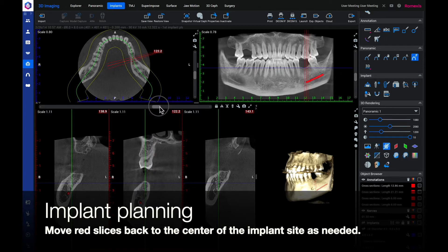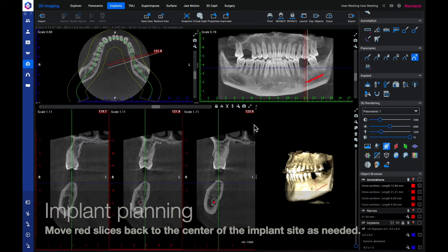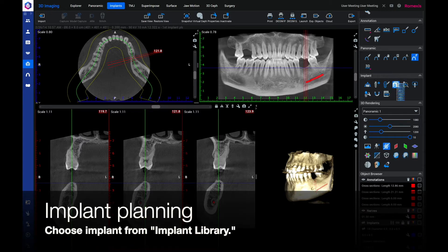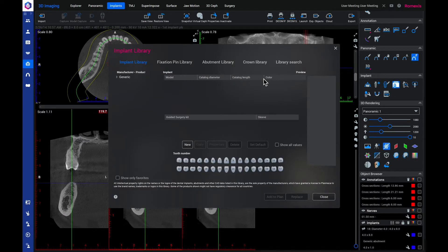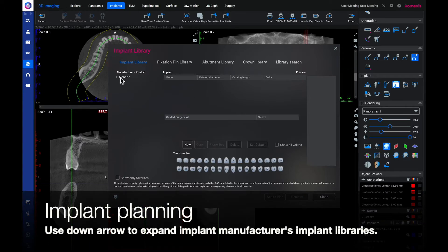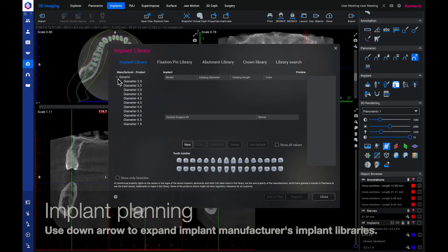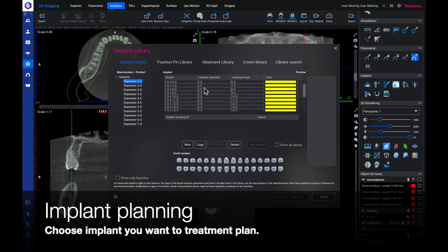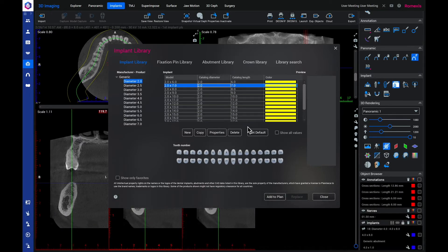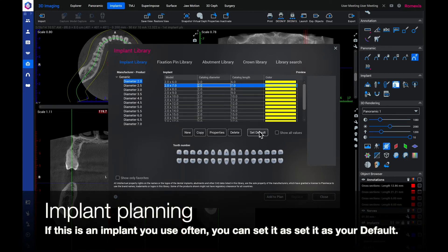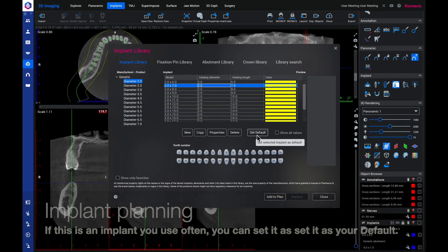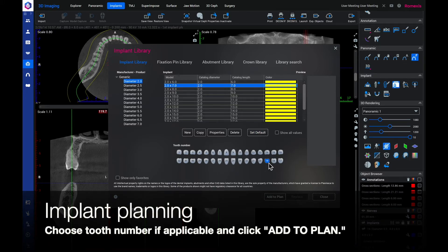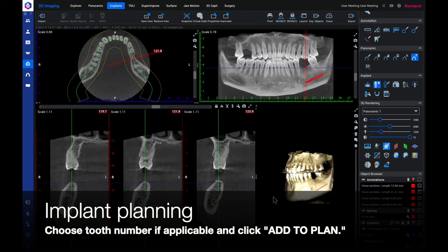Check the accuracy of the nerve placement and make adjustments in the slices where necessary. To set the nerve placement, click anywhere on the screen. Move the red slices back to the center of the implant if needed. Choose an implant from your implant library. Use the down arrow to expand the implant manufacturer's implant libraries. Choose the implant you want to treatment plan. If this is an implant you use often, you can set it as your default. Choose the tooth number if applicable and click Add to Plan.